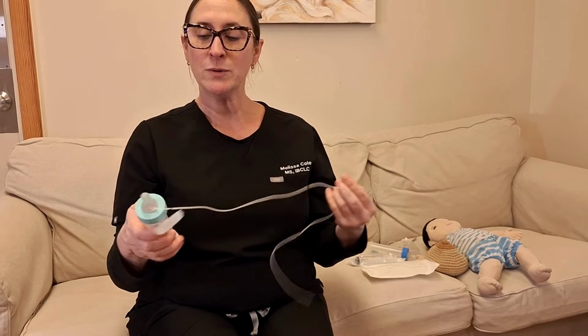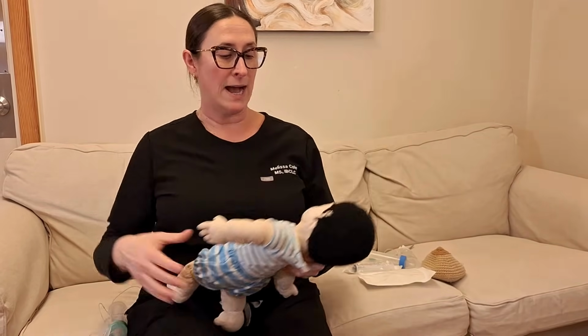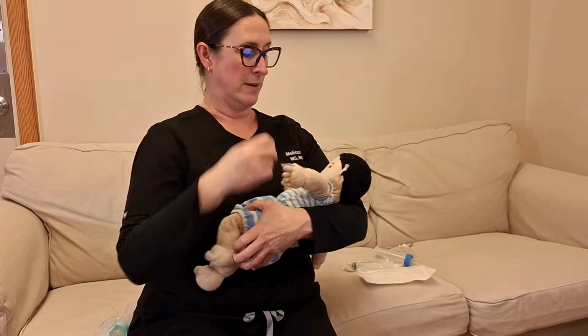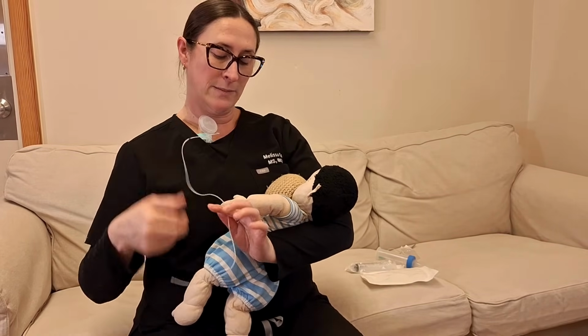And now for getting the baby set up, this typically works best for babies that are already latching. If your baby does require supplementation or is struggling to latch, and that is your personal goal, please be working with your experienced IBCLC to get support in meeting those goals. So typically I'll encourage a parent to have this set either in their top or off to the side. If their baby is a latching baby, it can work well to have their baby get latched on. Right, so say their baby is latched, they're comfortable, but we just need to add some flow or supplementation. This is where our little tube device can come in handy.